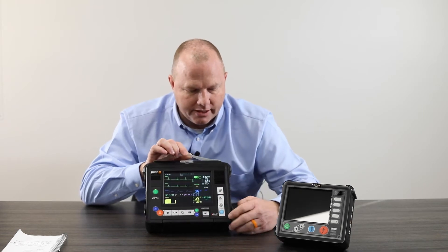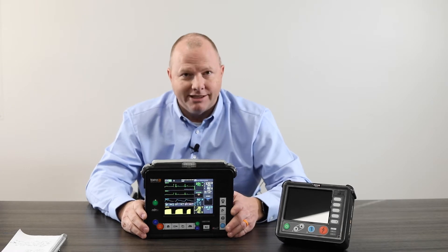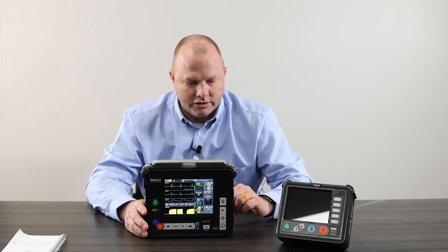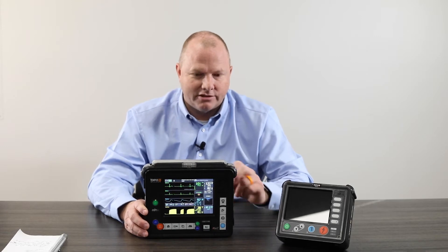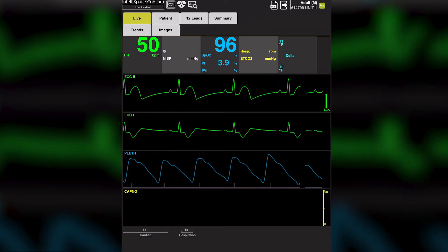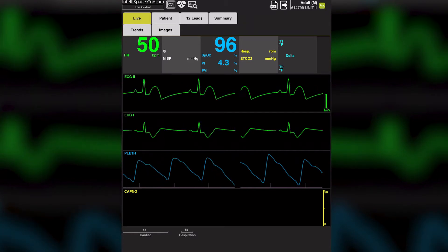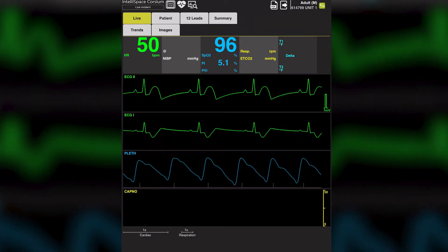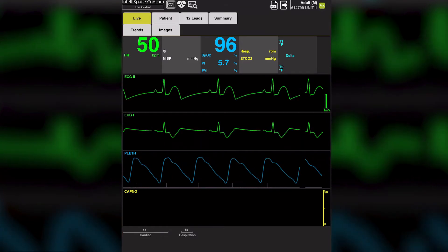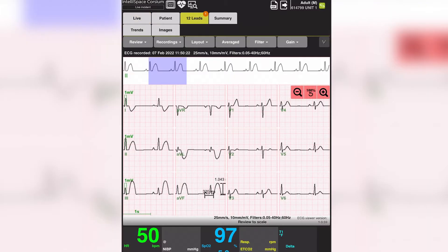This unit also pushes everything to a cloud-based system called Corsium. That's what really sets it apart from all the other units in the market. Corsium is a cloud-based system where the physician in the emergency room is looking at a live real-time view of every parameter on the monitor. You're not just pushing a button and transmitting a 12-lead to an email — they're actually looking at every bit of data from this patient and can make clinical decisions based on what they see.